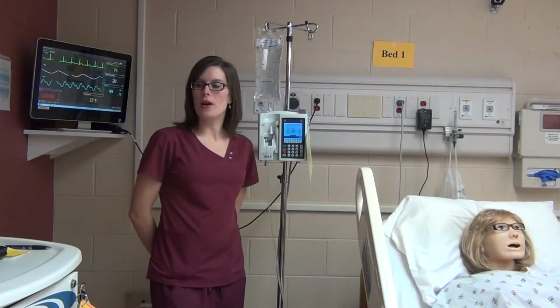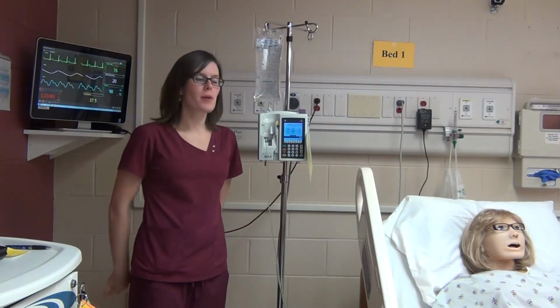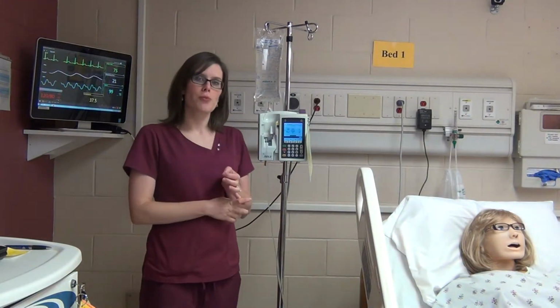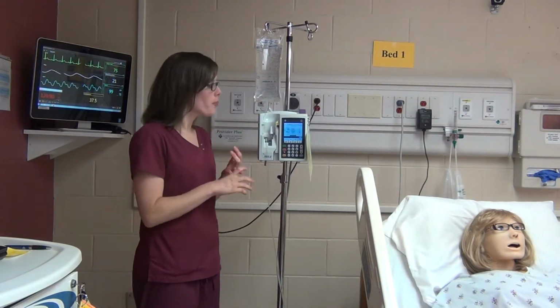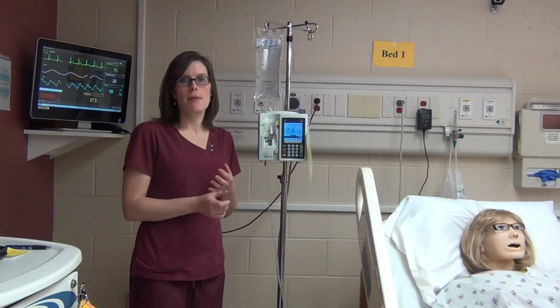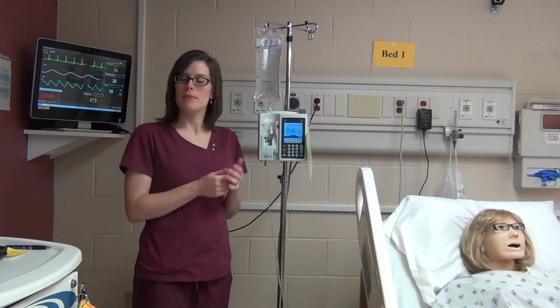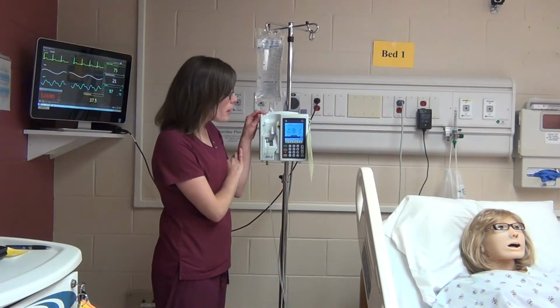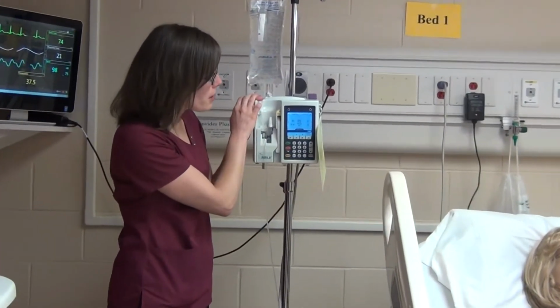Hi everyone. So today we want to show you a little bit of the IV pump and teach you how to change the rate on a primary bag or primary infusion, and then how to hang a secondary piggyback, maybe like an antibiotic, something like that. So we'll go ahead and zoom in, and you can see we have a primary bag hanging here.